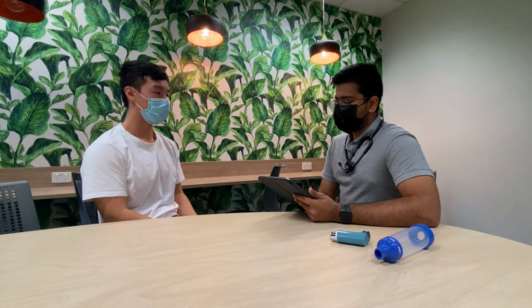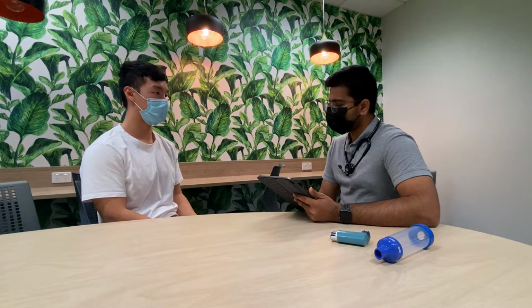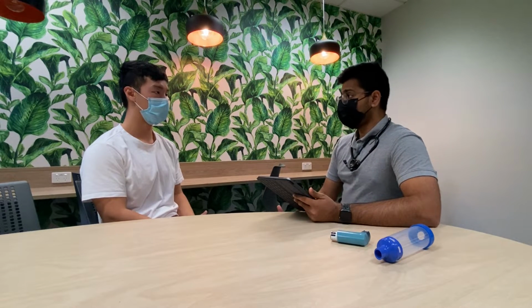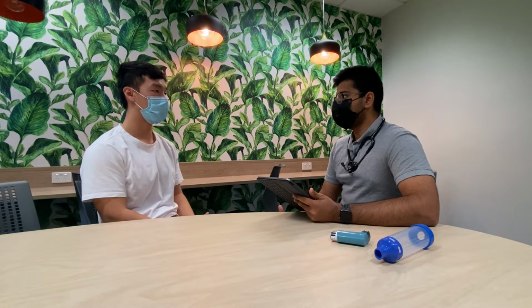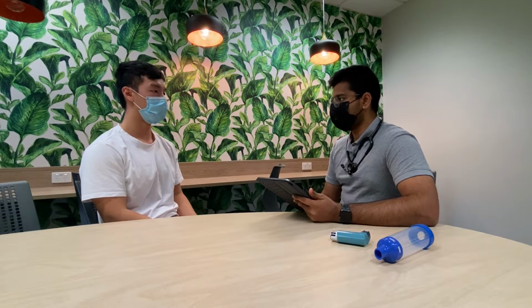Adrian. So, our young fellow, we have Justin, who's a 21-year-old who came in for his first severe asthma attack. He is now stable and ready for discharge. I thought this would be a great teaching opportunity for you to give him some counseling around the use of an asthma inhaler, a preventer, and a spacer.